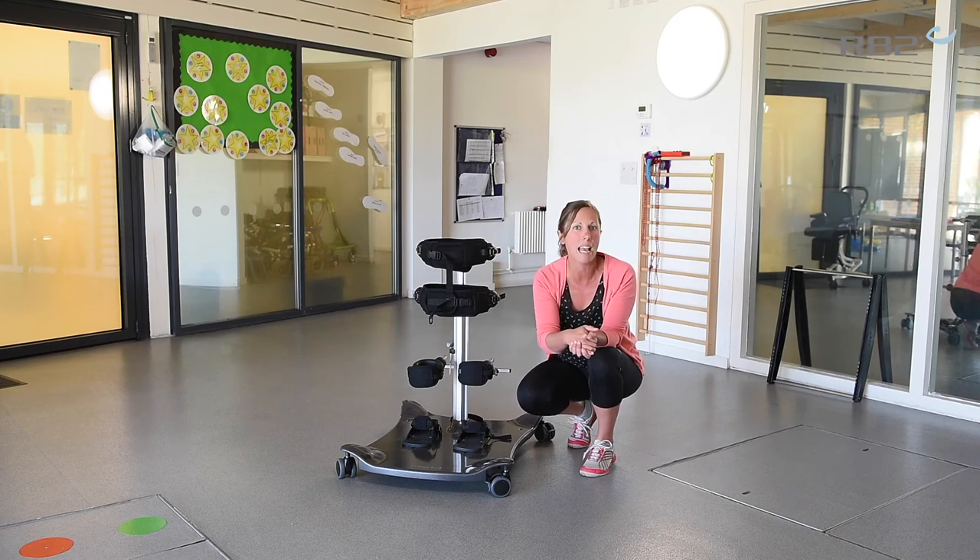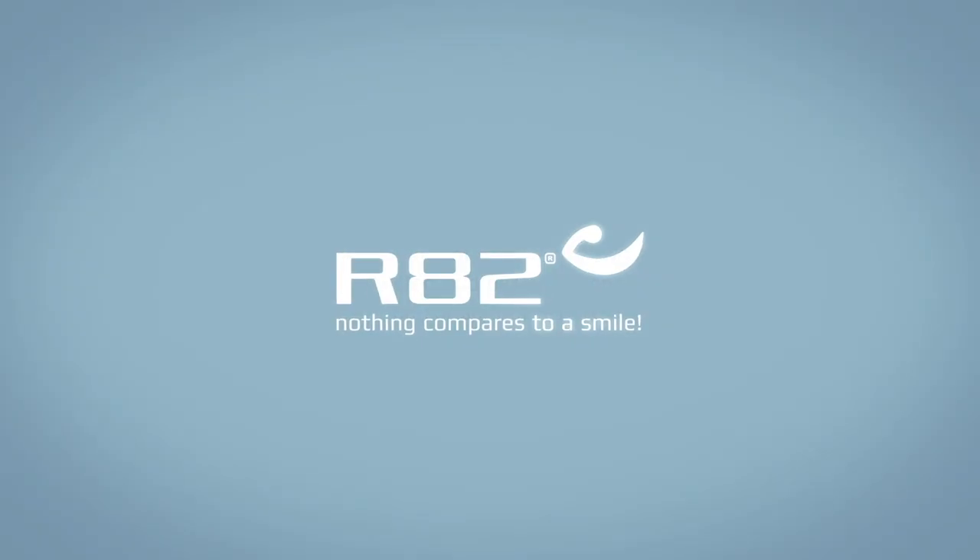And that's how you'd use the meerkat in both anterior and posterior settings. Thank you so much for listening.